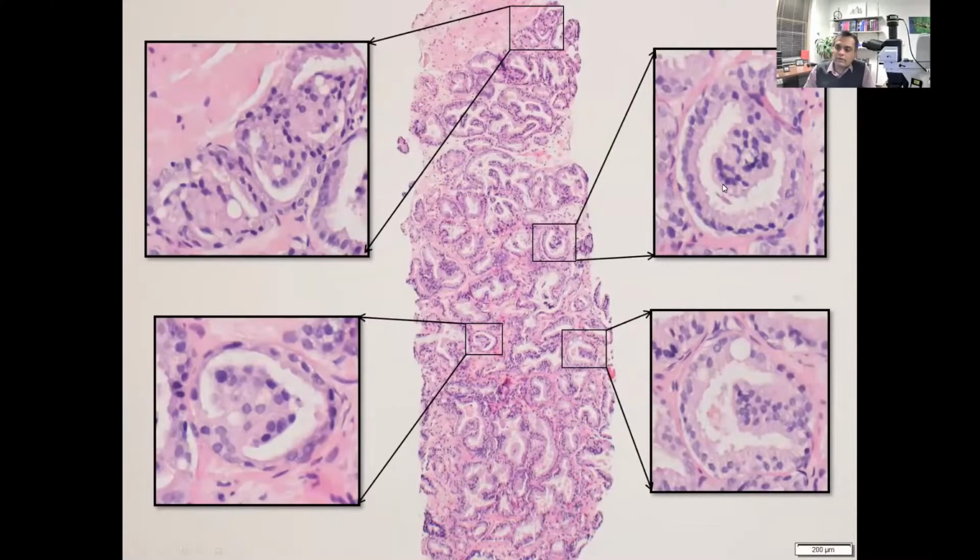And on the luminal side, you still see the clearing of cytoplasm and this columnar appearance, which is very similar to what you see in the other area of the gland. So you can imagine how this invaginated and took on the same appearance as this. And the same is happening over here. All the nuclei are oriented towards the center of this invaginating cluster. And then on the sides, you see the cytoplasm.